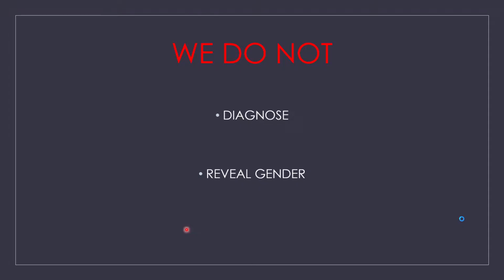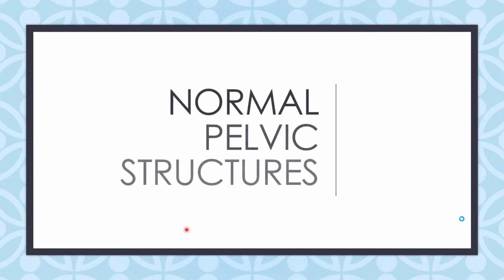We do not diagnose and we do not reveal gender. That may vary at some of the facilities, but as far as the diagnostic portion, we do not diagnose. It is a limited OB ultrasound.